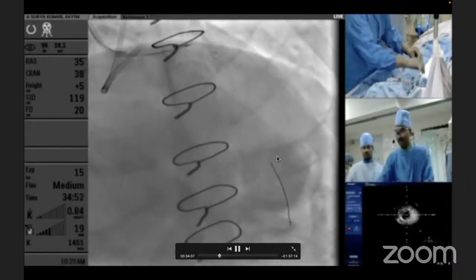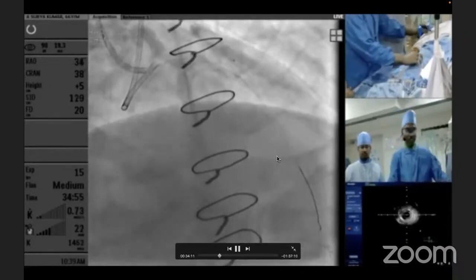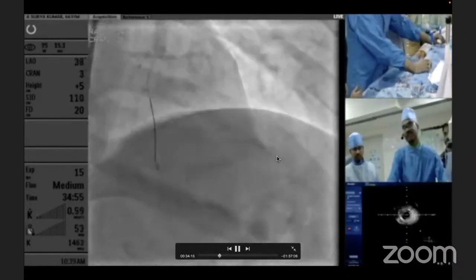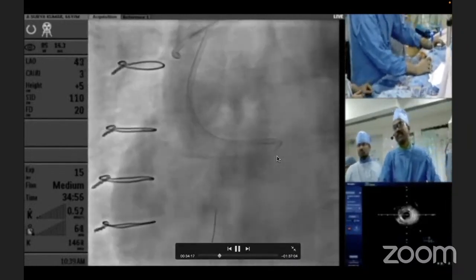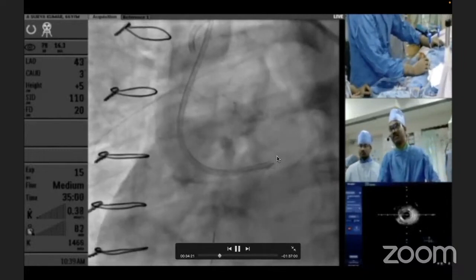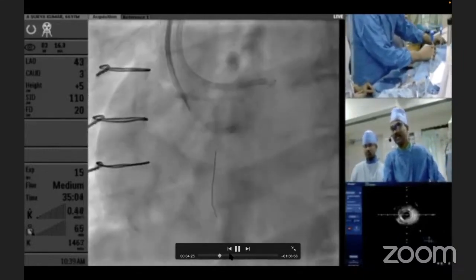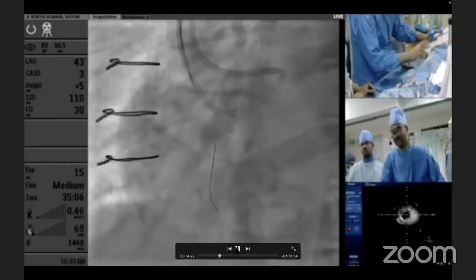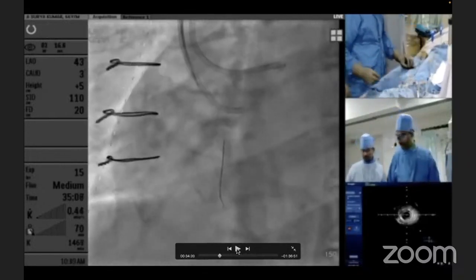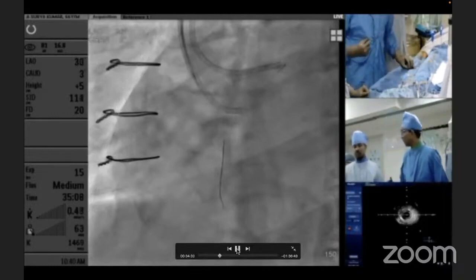We don't need this. Go to yellow, please. We removed the diagonal side. To avoid triple injection, we are using sequential double injection. Now I think I'll use this for RCA. You can see this, Himanshu, same guide. Now I'm switching into RCA, but with a JR for RCA.